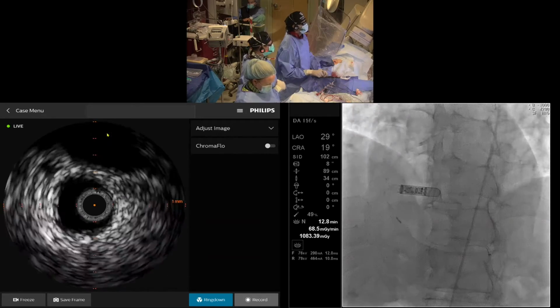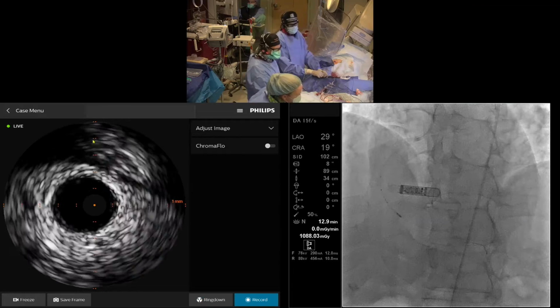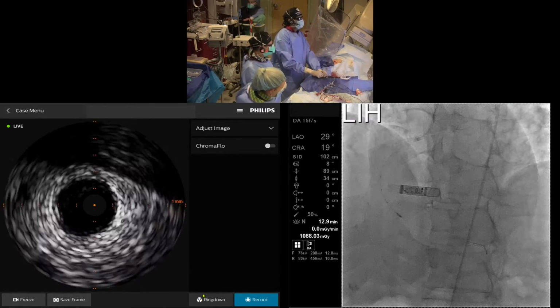So I'm just going to come to the distal stent edge. Can you hit ring down? Wait. Okay. Are we ready for pullback? Can you record, please? Record, please.